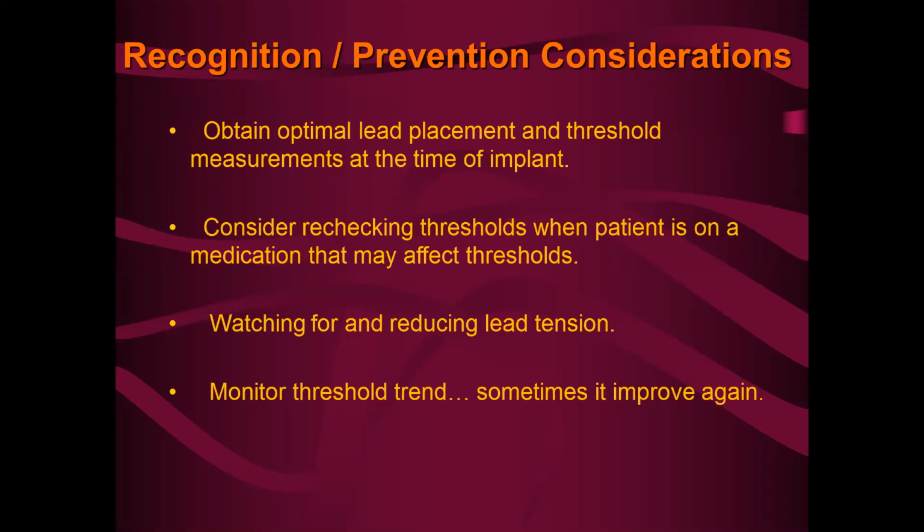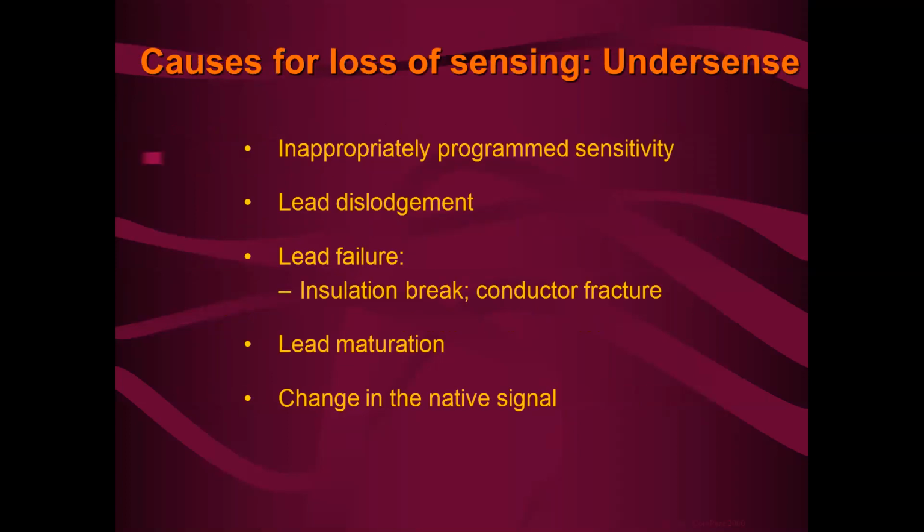So that's what I always tell the pacemaker patients and families, that if we see any changes in the pacemaker clinic, we don't jump right away to replace the system. We always just try to manage with the system. If I have to increase the maximum output of the pacemaker in order to maintain the safety margin, we'll do that and just let the battery wear out if it needs to. And we'll just wait and see if the threshold level will come back down again. And sometimes it does, and it saves the patients from getting additional surgery and additional hardware inside the body.